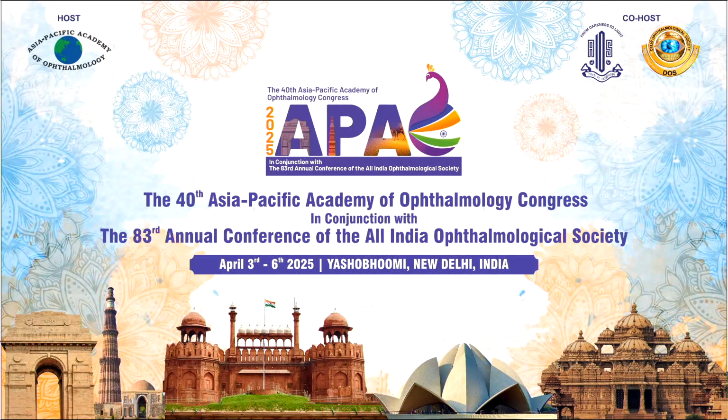Dr. Kumar, I would like to ask you on this case, what was the primary reason for decentration of this IOL? I think you can realize that the lens was lying in the sulcus, and some zonules inferiorly must be compromised during the primary surgery. So then ultimately over time these lenses subluxate a little bit and they move downwards. Luckily for us that we can now refix them, so there's no other fear.